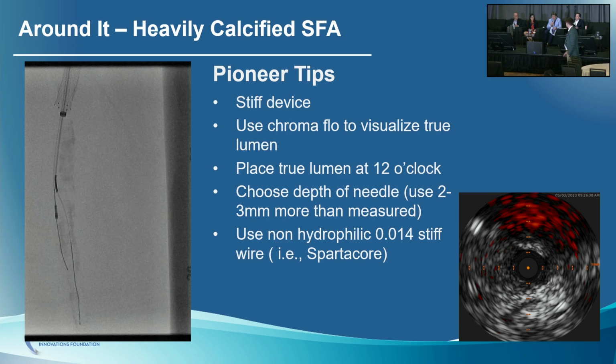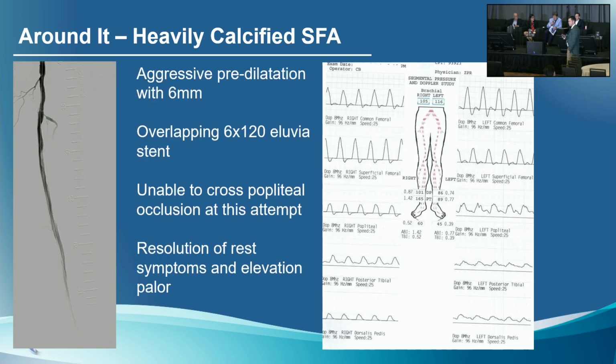Can you go back to your picture, the last picture? The only other thing I'd say is, if you're going to put a scaffold here, if you look at 30, on your tape, by the way, I love the tape being there. I think we should all do it. But if you're going to treat a calcified lesion like this with a scaffold, the better scaffold is an interwoven stent, bar none.